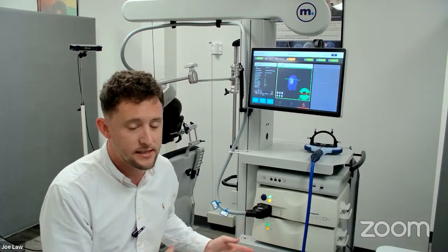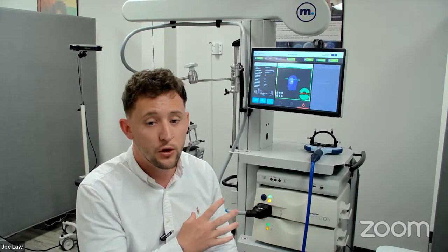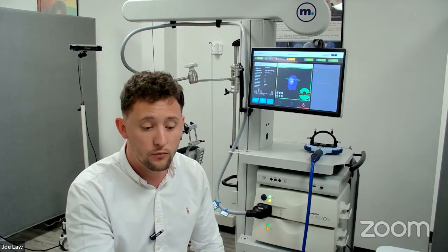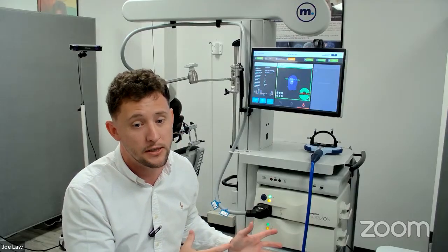Previously, with the cap method, there was no way unless you were present at the treatment to know exactly how well that treatment went. The beauty of this system is, if you're admin of the system or you head the TMS department, even if you're not in the clinic, you can log on remotely on a laptop or desktop and see exactly how well your treatments went.